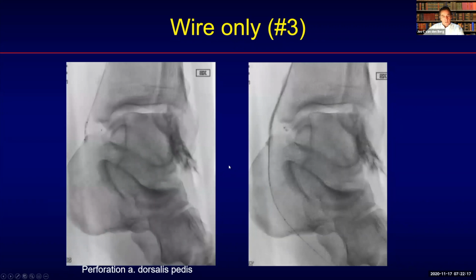Even if this patient needed a revascularization of the anterior circulation, and the posterior tibial artery was not of a good quality either, I managed to get all the way down into the posterior tibial artery afterwards, and you can see injection of contrast now indicating that I'm still intraluminal. There's a small collateral that you see filling here, and then it was possible to advance the guide wire, and again a short balloon, the Armada XT, which is the CTO balloon that I already mentioned before.